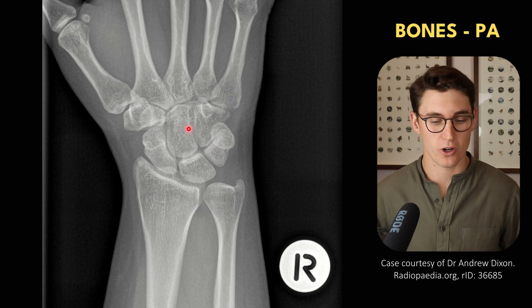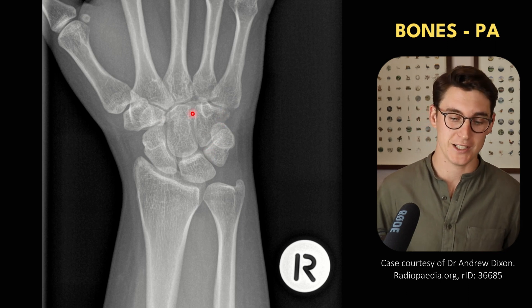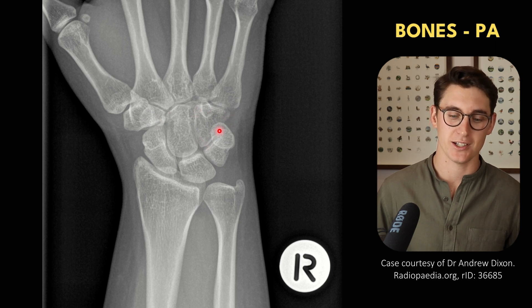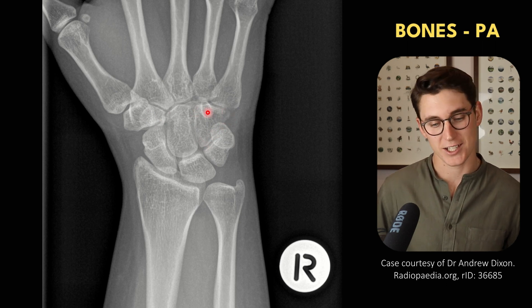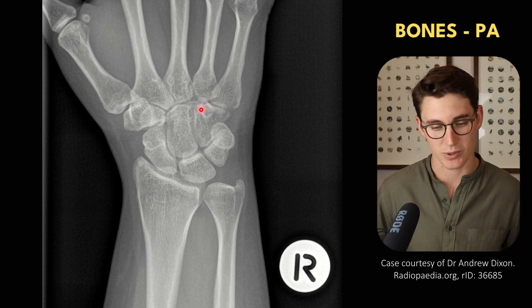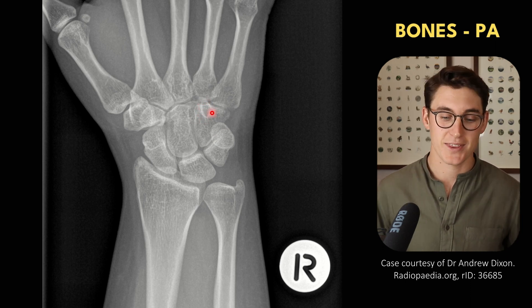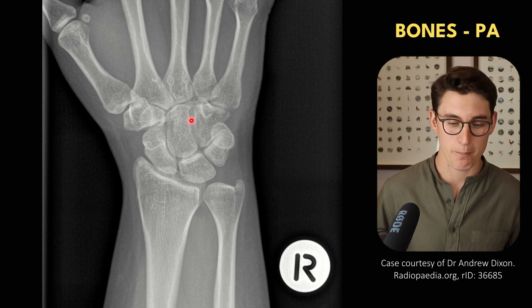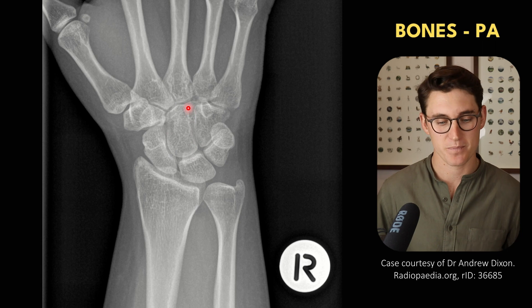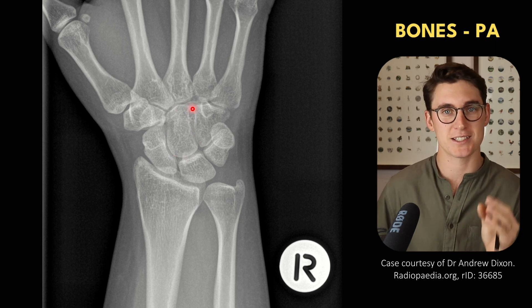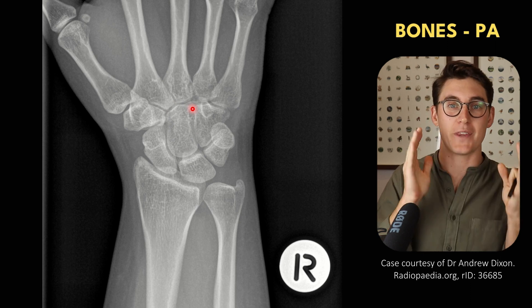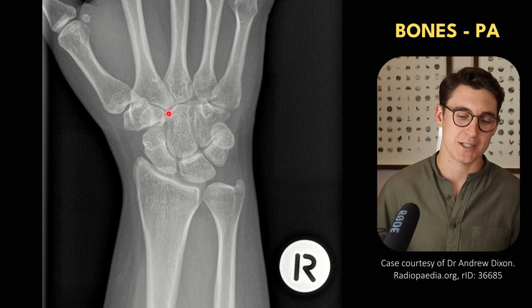Our distal row of carpal bones — starting medially and heading laterally. We have our hamate bone, which is quite unique. It has a projection of bone called the hook of the hamate. Then lateral to the hamate is our capitate bone — capitate meaning head shaped. It's the biggest, central bone of the wrist — the capital bone.